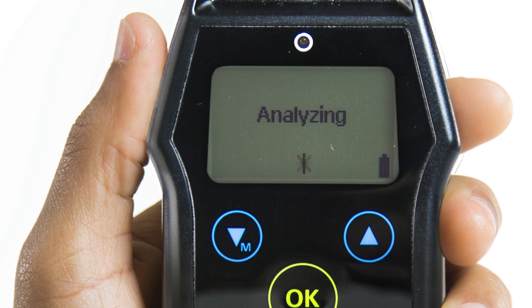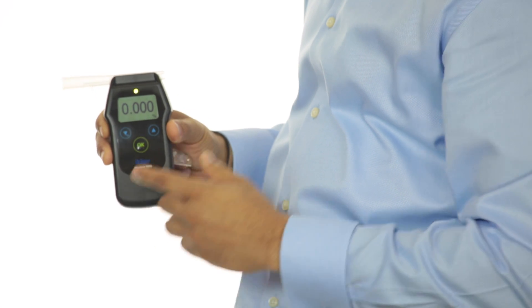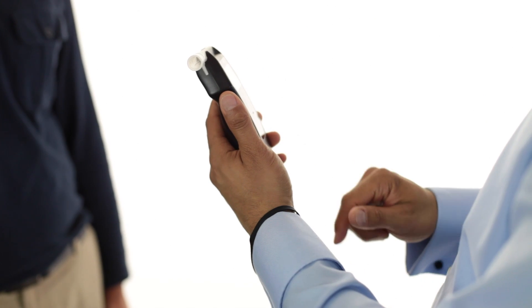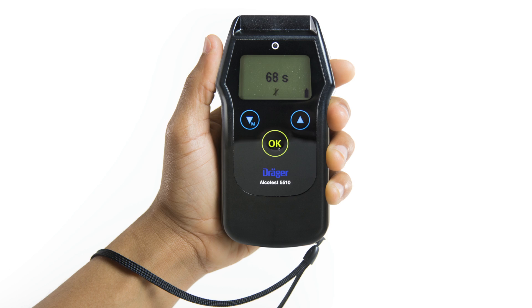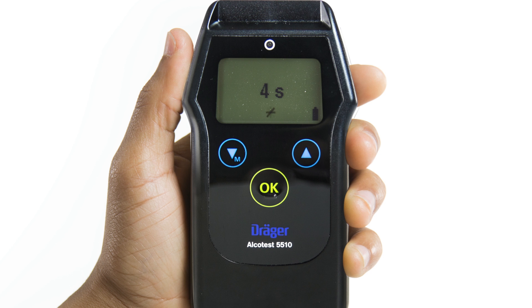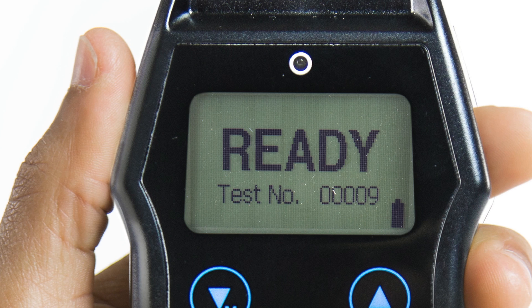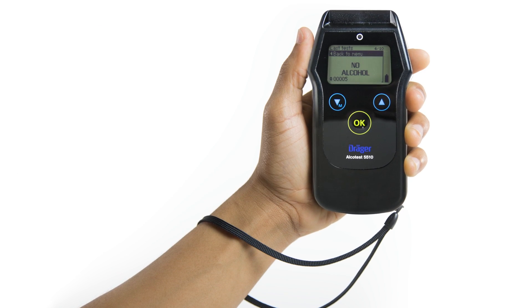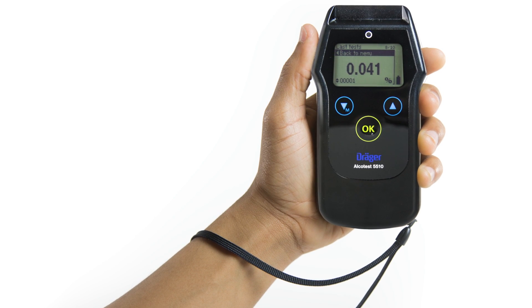'Analyzing' will then appear on the display screen. After a short time, the test result will appear on the screen. Results can be displayed in over 10 different units of measure or in a pass-alert-fail format, depending on your jurisdiction. Once you are ready to take another test, press OK. While the device prepares, a recovery countdown will show on the screen. The greater the alcohol concentration of the previous breath sample, the longer it will take the fuel cell to recover. When the device is ready for another test, the screen will display 'ready' along with a new test number. Each test is given a unique sequential test number for accurate identification. The device stores the last 10 measurement results with their respective test numbers, overwritten in a first-in, first-out sequence.